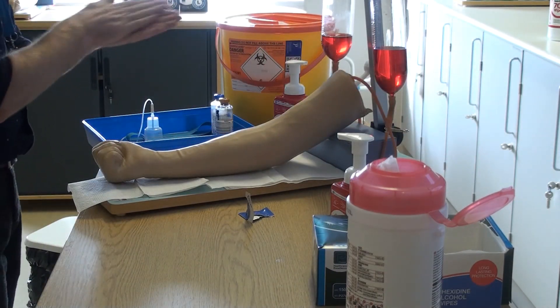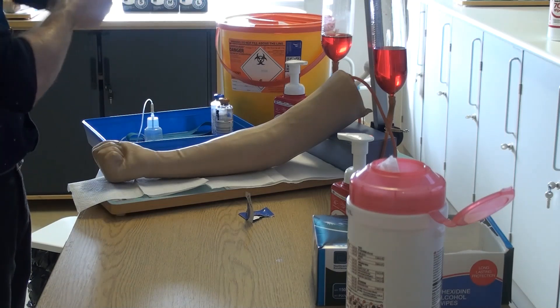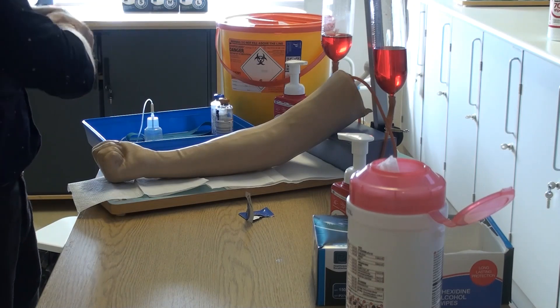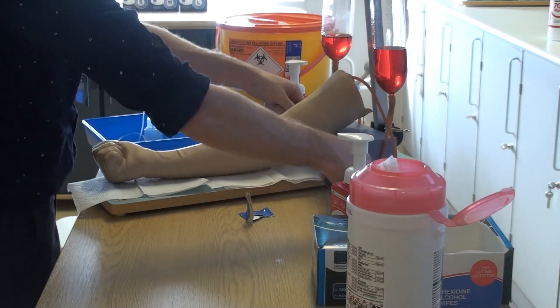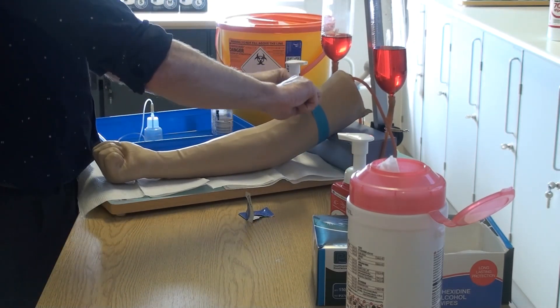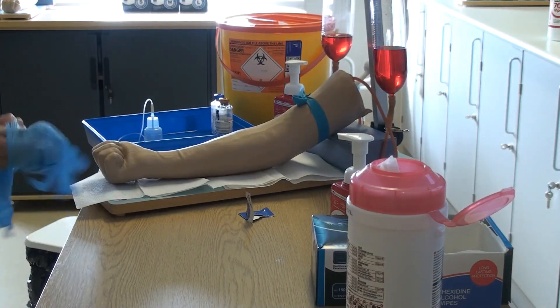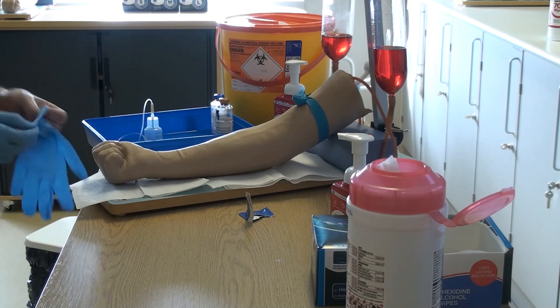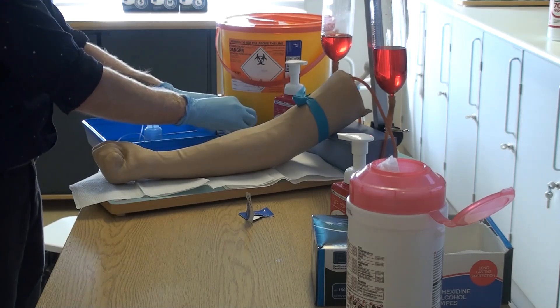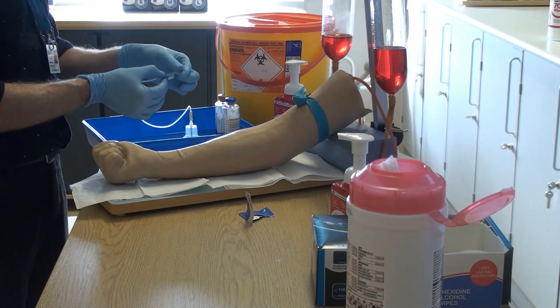Decontaminate hands once again and apply the tourniquet onto the arm, 10 centimetres above the sample site. Apply non-sterile gloves and ensure that you do not repalpate the skin again before injection occurs. Arrange the bottles so that the aerobic bottle is closest to the patient and sampled first.